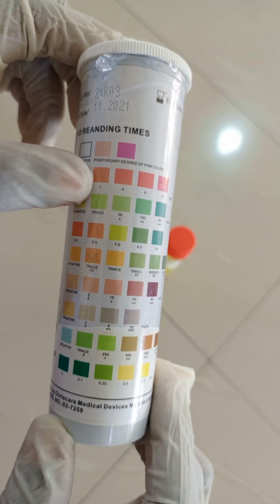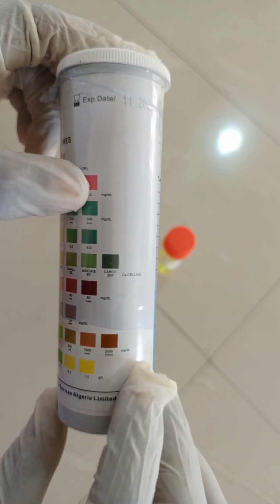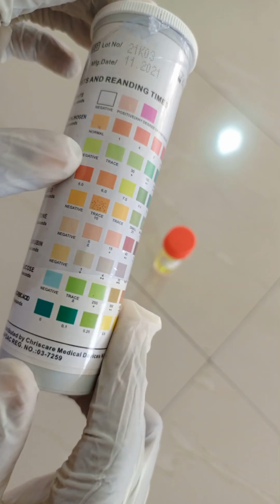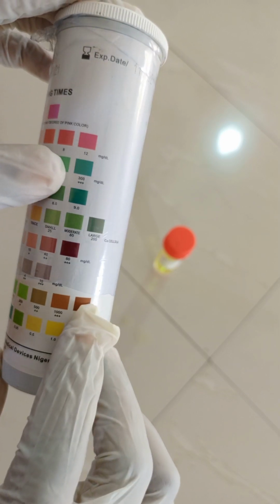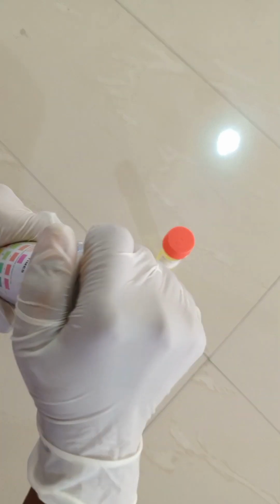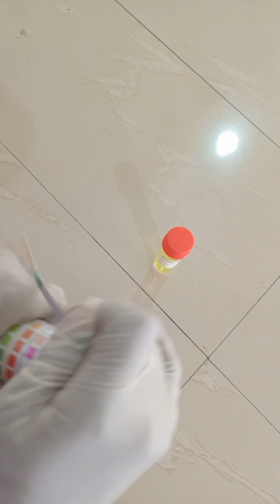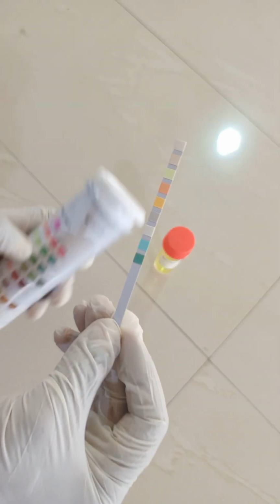All right, any degree of pink color. So if the pink color changes, that tells you the grade of the presence. Some of them have numbers, and then some of them have 1 plus, 2 plus, 3 plus, and the rest. So this test is quite simple. Once you open up this, you collect the strip you want to use, and then you cover it back very well. This is the strip.